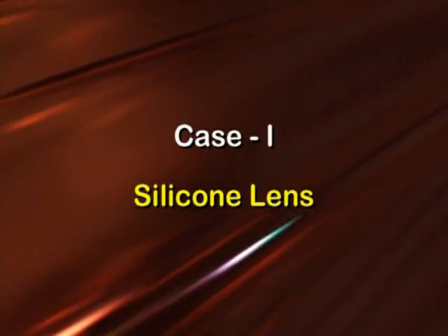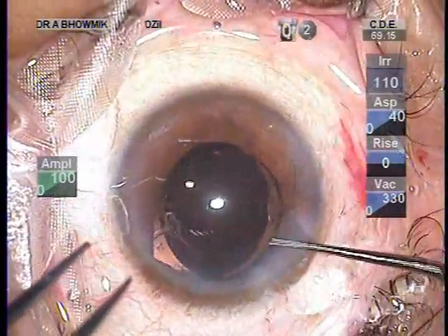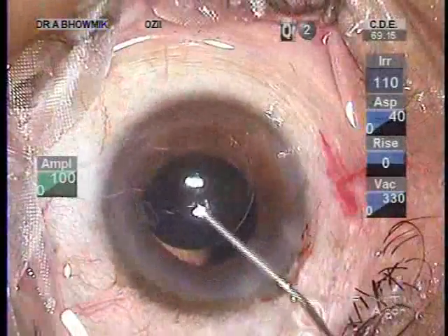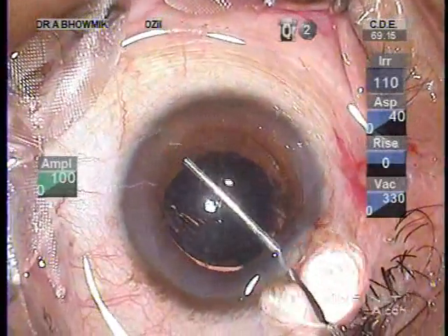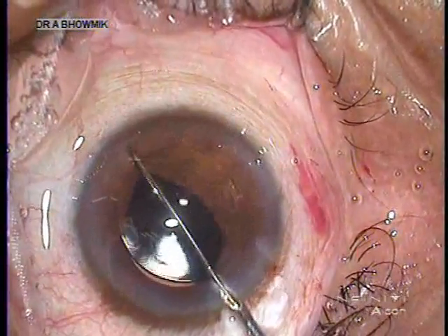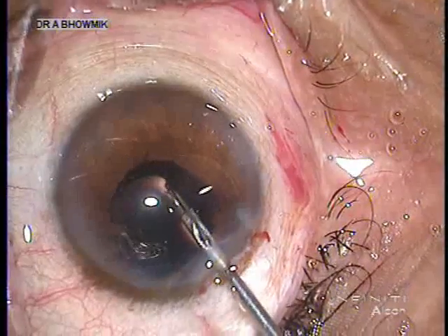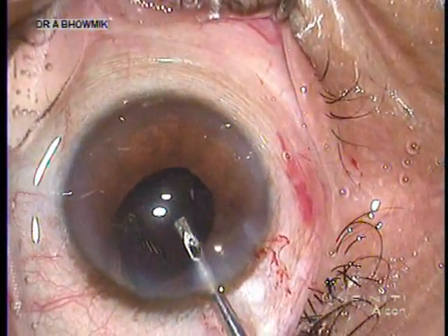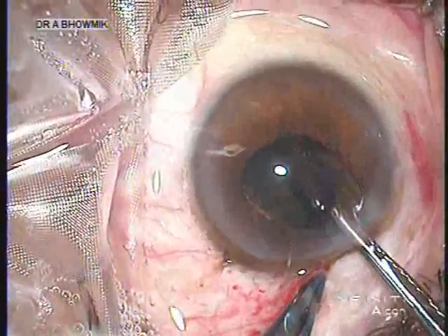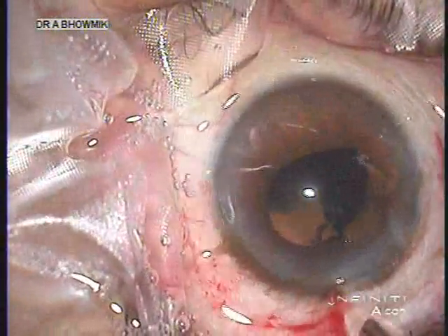A silicone lens was damaged during implantation and prolapsed into the anterior chamber. One haptic was cut to facilitate the looping of the snare around the optic — if both haptics were cut at this stage, the optic may slip under the snare loop. The snare cheese-wired the optic into two pieces effortlessly. It is mandatory to use dispersive viscoelastic liberally at all stages to protect the corneal endothelium and the posterior capsule. Pieces of the IOL were then explanted through the same incision with forceps, one after the other.